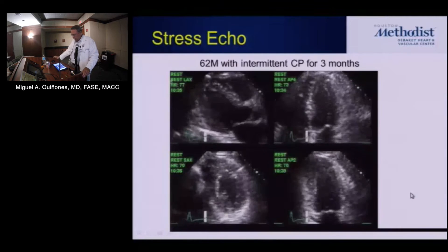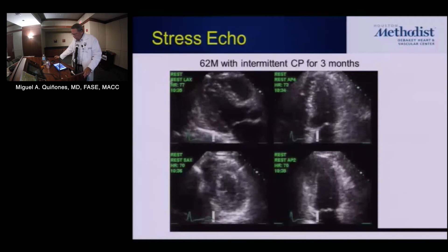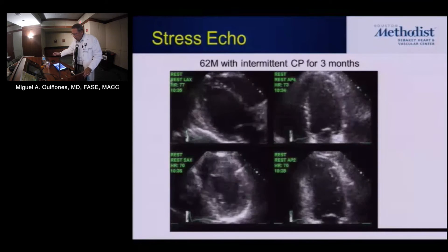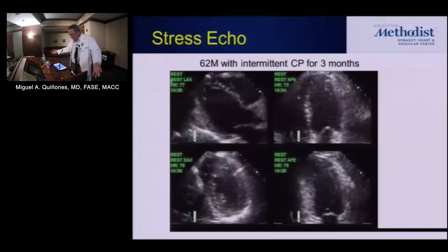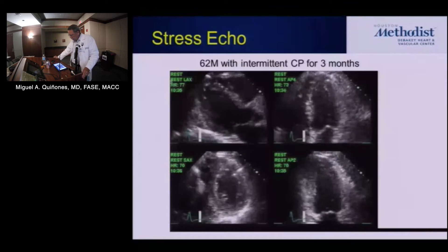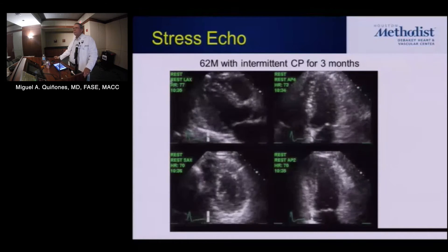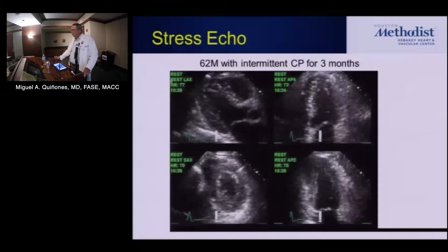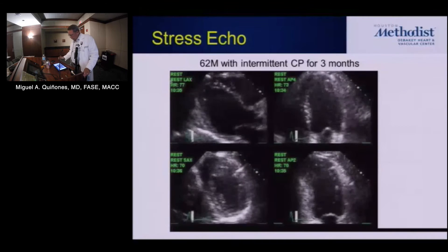So let's take it now to stress echo. This is a 62-year-old man with chest pain. Does anybody see anything abnormal by eye? Good, because I don't either.